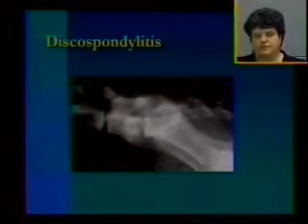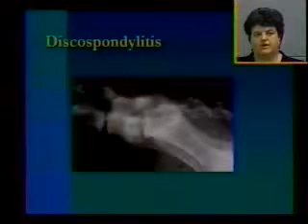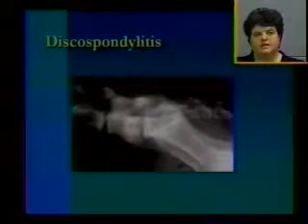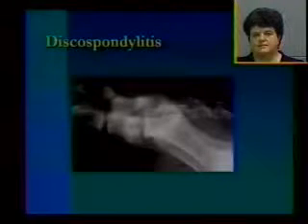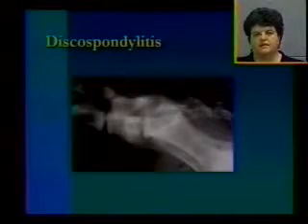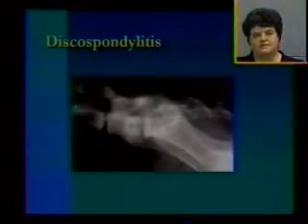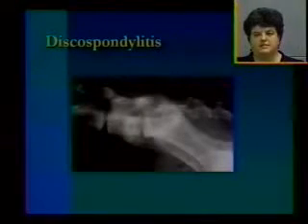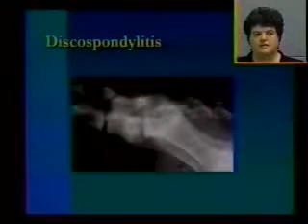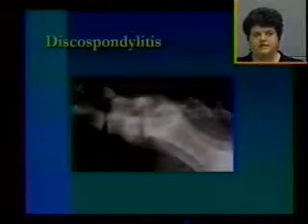Just one more aggressive bone lesion. They can occur in the axial skeleton. They don't only occur in the appendicular skeleton. And what we see at this lumbosacral junction is discospondylitis. Discospondylitis is an infection of the intervertebral disc. It's hematogenous in origin, most likely, and the radiographic signs are the irregular end plates of the vertebrae, which is the bone facing the intervertebral disc space. They will have an irregular contour in areas of lucency, which you see in this case.